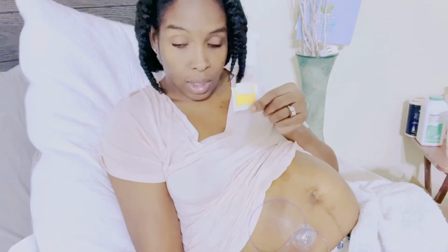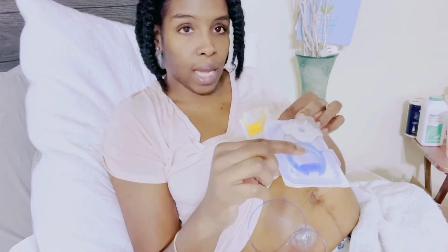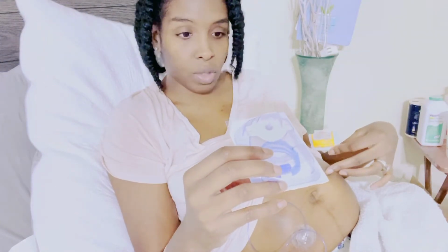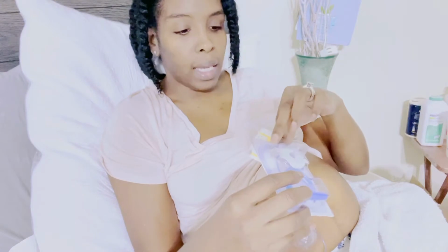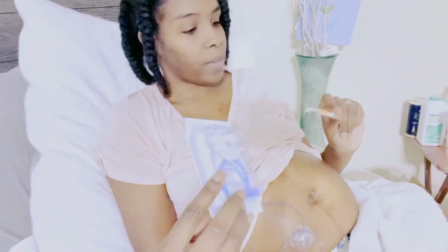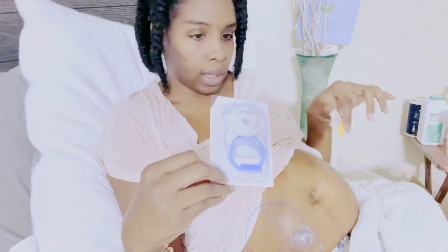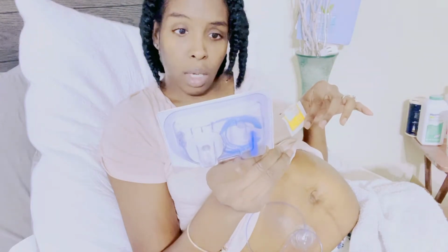I'm going to tear open an alcohol pad, because that's what I'm going to need right now, the alcohol pad and this kit here to change out the site and tube. That's a needle connected. Once you pull the needle out, the catheter stays inside of your stomach, and the medication comes through this blue cord and through that cap that we're going to put on top of that, and then it goes into your system. All you're going to need to change your site is an alcohol pad to clean the area and your new infusion set.